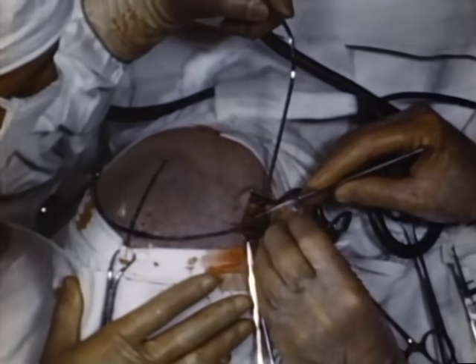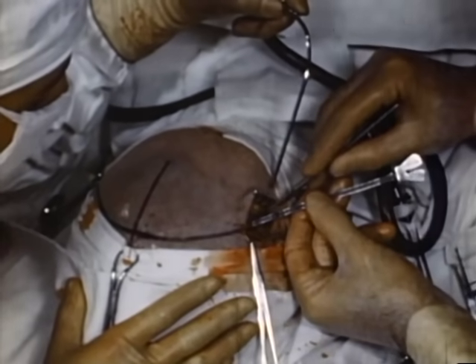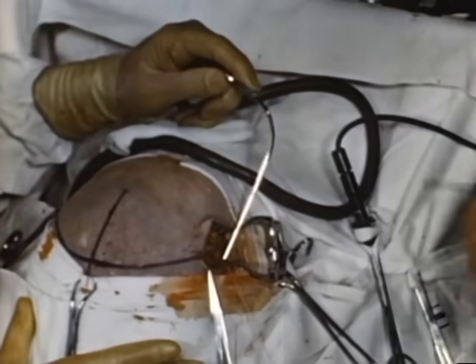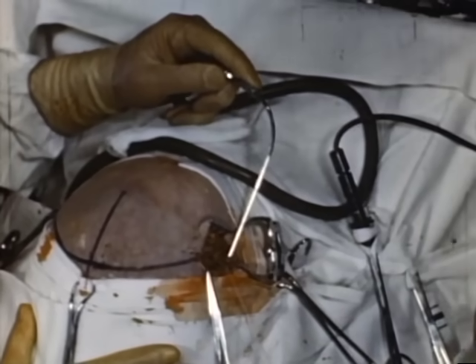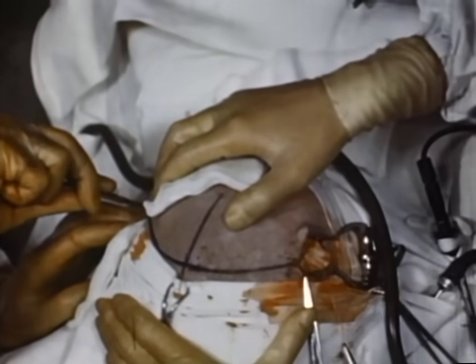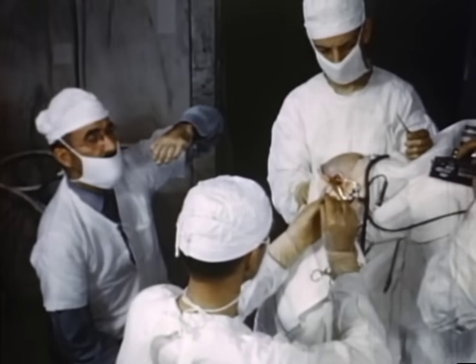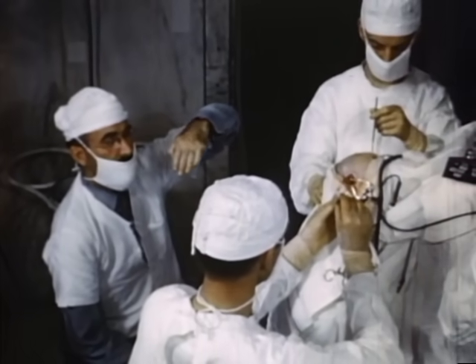The dura is opened and the cortex is punctured in an avascular area, following which the leucotome and the nasal septum periosteal elevator are introduced. A similar opening is then made on the opposite side. The surgeon inserts the leucotome into the brain, guided by the neurologist in order to keep the brain incision constantly in the plane of the coronal suture. His first move is to penetrate directly through the brain from one opening in the skull to the other.